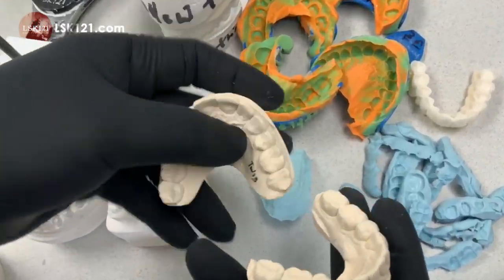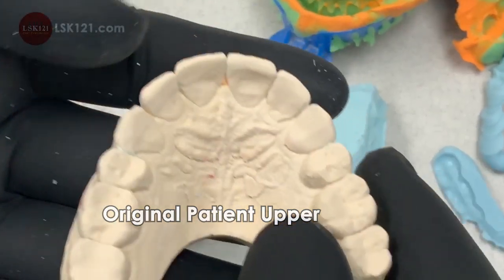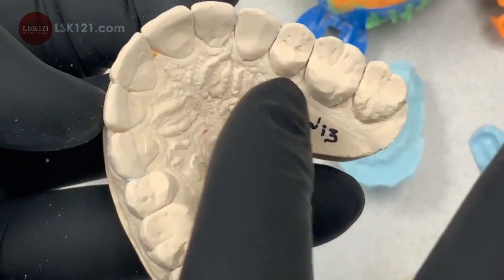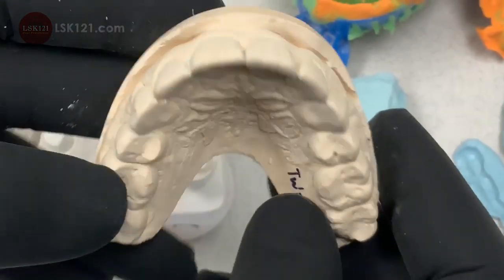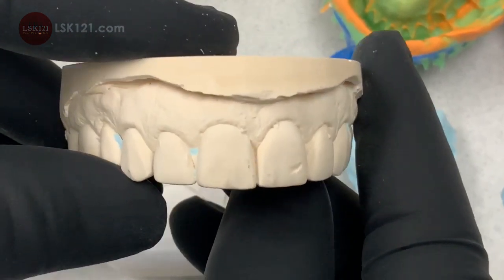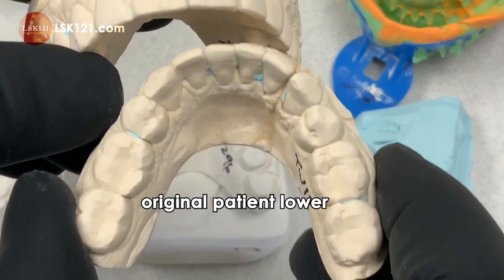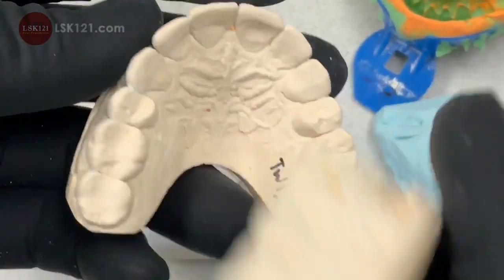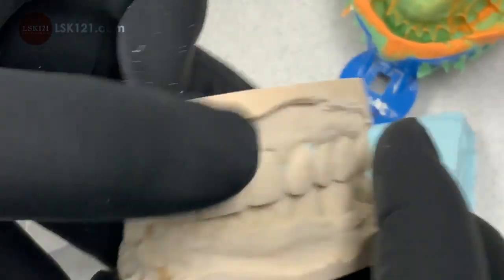Starting here: the patient had previous veneers, crowns, and natural teeth. The natural teeth are cracking — it's a really deep bite. The patient kind of knows this but isn't 100% sure. When I checked the lower teeth, same thing — all veneers on the lower and all grind teeth. That's why I chose zirconia monolith here.